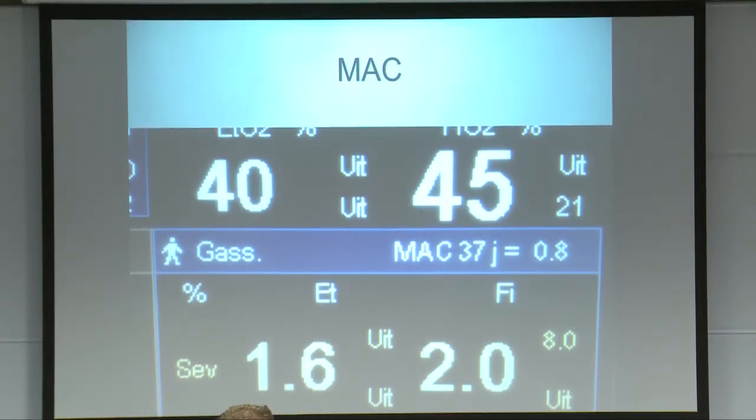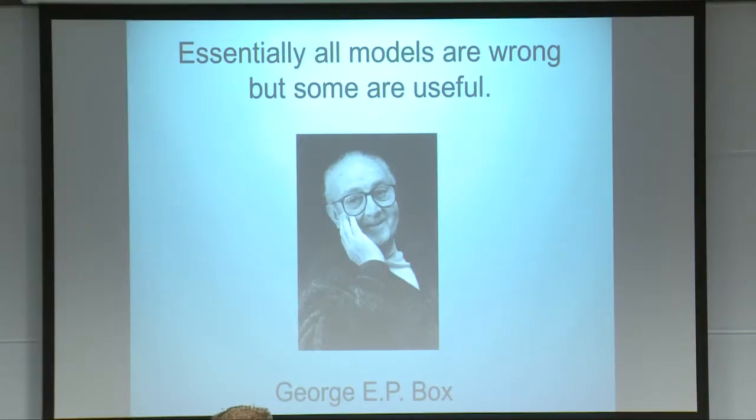Now, that is great, but it still doesn't give us information about other drugs we use, like IV hypnotics and opioids. Therefore, we must travel to the mystic land of PKPD, where smart people and supercomputers are working on difficult mathematical models. With these models, they're able to calculate effect site concentrations. That is great, but we use various drugs at the same time, and these drugs work on the same clinical effects. This is called combined drug effects.